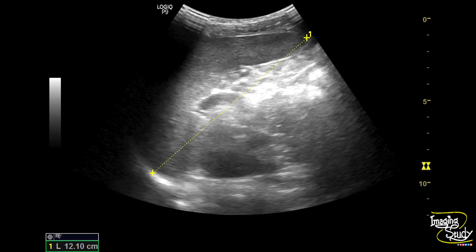Here's the measurement, and you can see the length of the spleen is 12.1 centimeters. In an adult patient, if the length is 12 centimeters or more, it is known as mild splenomegaly.